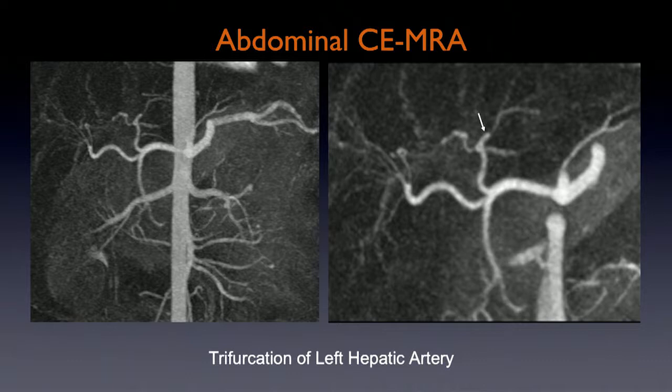I think seeing stenoses in these vessels is challenging. It's difficult to appreciate whether or not these are just tortuous vessels or stenoses because of the MIP technique. But on the partition data, you can see it's just that the vessel's a little tortuous out there.